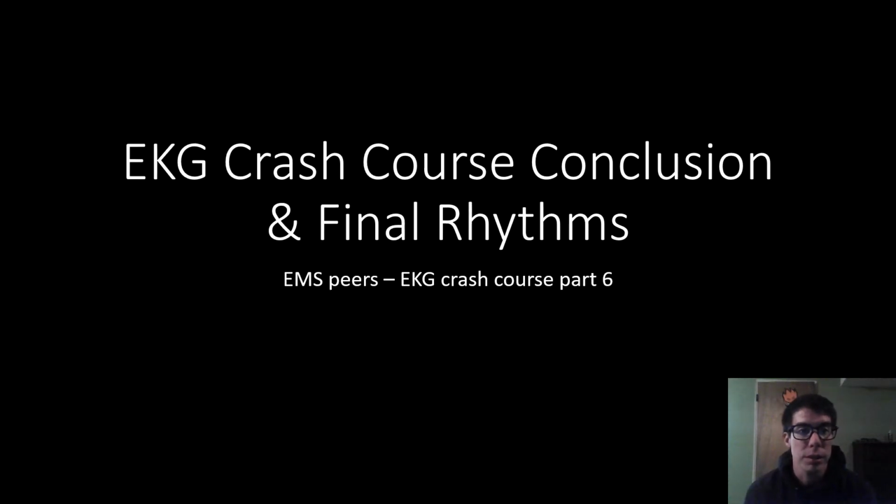Today, this is our final video on EKGs. So we're just going to cover some review of the most pertinent stuff, and then we're just going to learn a couple more rhythms that didn't really fit into other parts of this. So I'm doing it now.